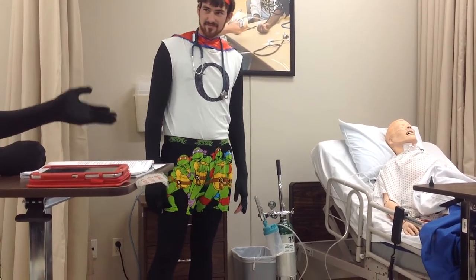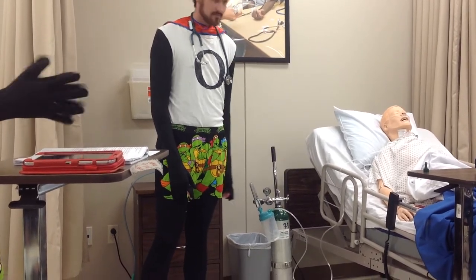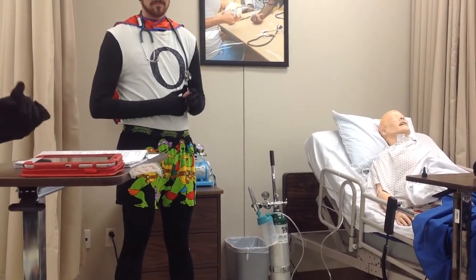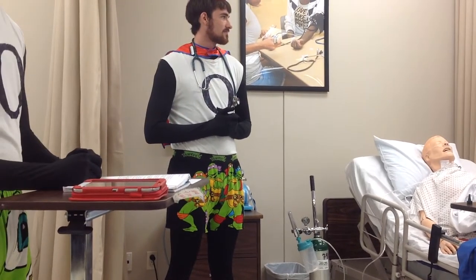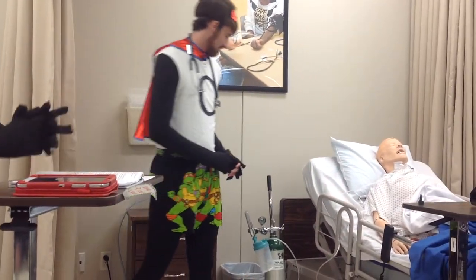Oh, and what type of oxygen, what kind of device, if it had humidification on it, anything like that. Also the liters. And that's how you would apply oxygen to a patient. Okay, and there are a bunch of different devices that you can use other than the nasal cannula.